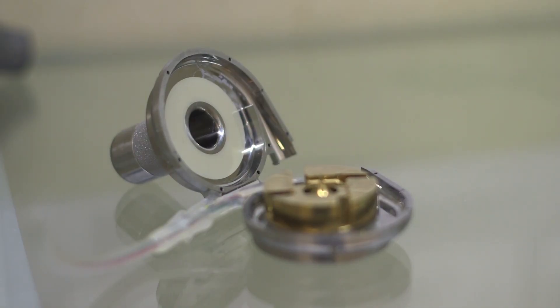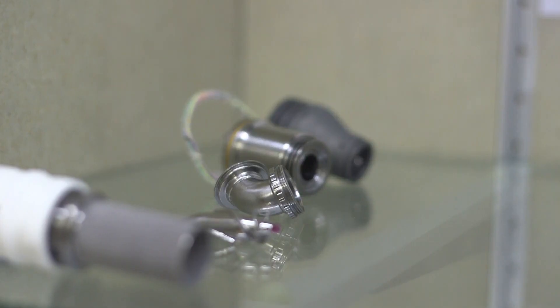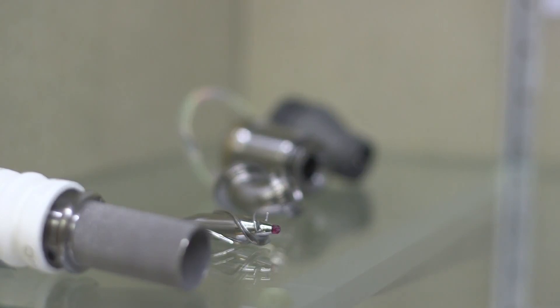Rotary blood pumps consist of many parts: the housing, inlet and outlet, impeller, bearing system, driving magnets, and so on.